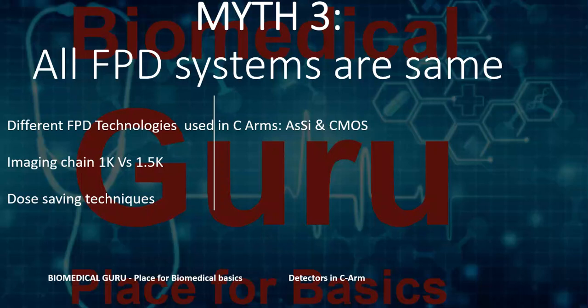Some high-end machines will have better dose saving techniques than the low-end machines. So all of this put together gives the overall value of the machine when it comes to a flat panel detector. And also there will be some image processing techniques which will increase the resolution, or which will better the user experience. All of them will also matter to the overall experience of the user.